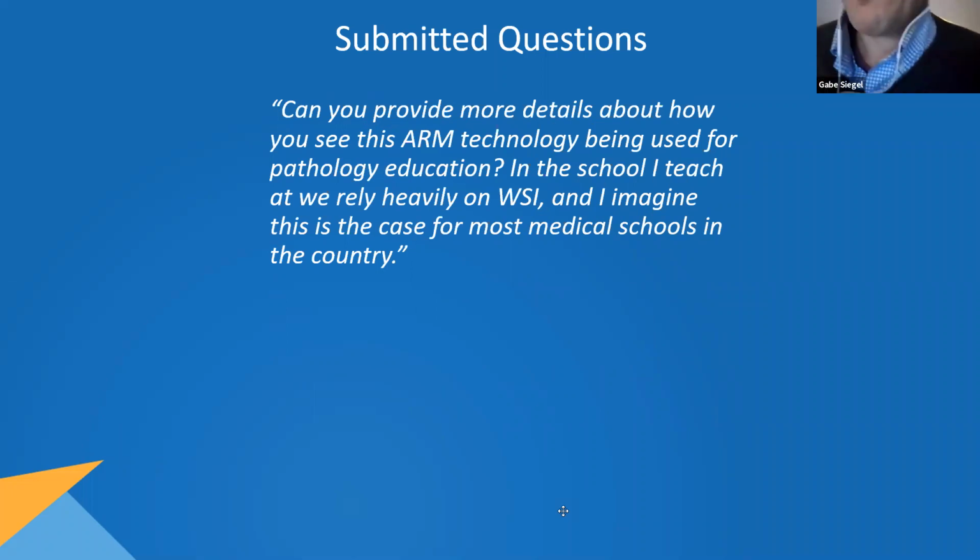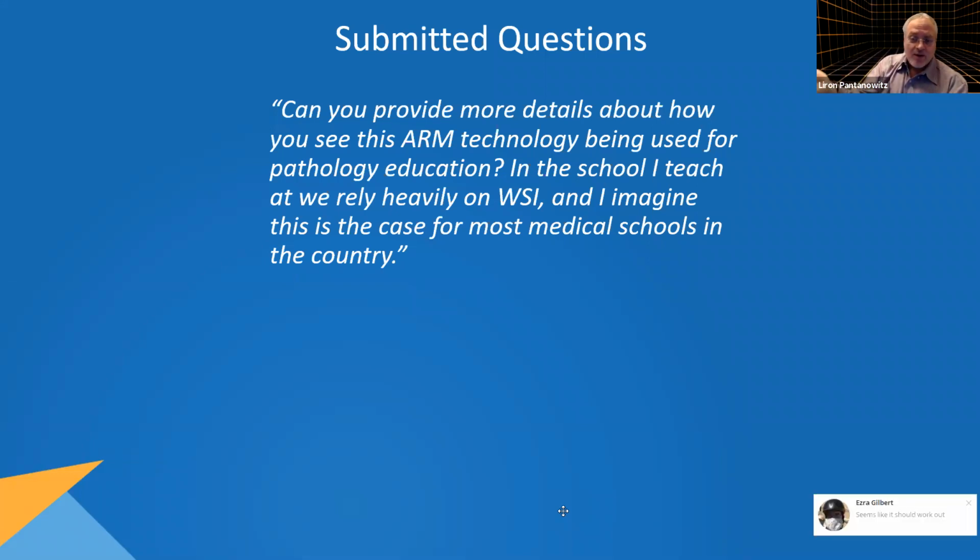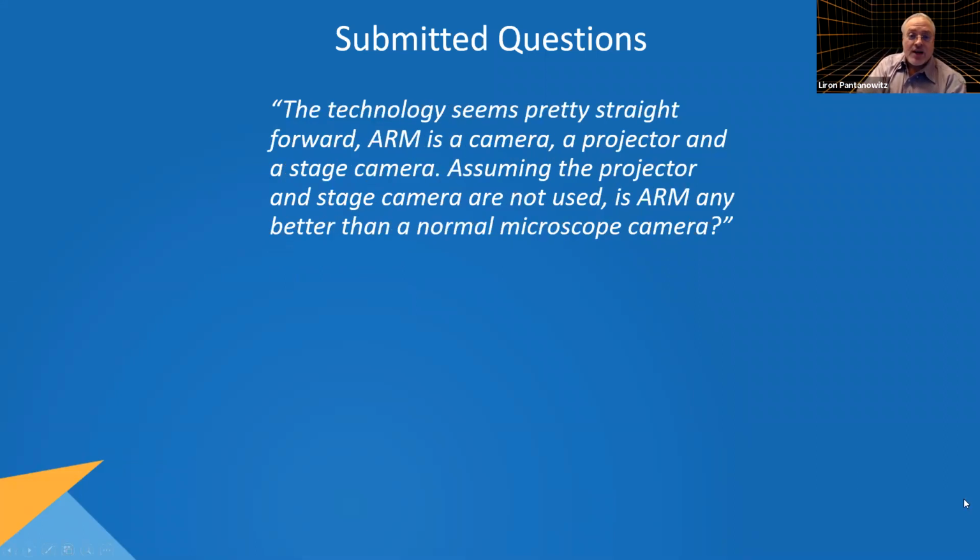Yeah, so most, Dan, I'll answer this and then you can follow, from veterinary practice. Most medical schools and actually allied health schools, dental, etc., have gotten rid of microscopes. They're expensive to maintain. Even maintaining the slides that people look at is expensive, and people don't include even the rare cases because it's hard to find a rare case, and you certainly get a lot of recuts. So digital pathology, whole slide imaging, has really been great from that point of view. Can ARM provide similar functionality for education?